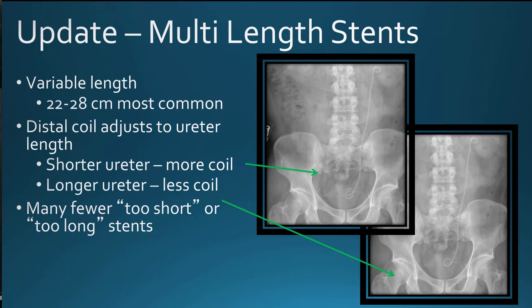Usually it's done at the time of stent placement, using the guide wire to calculate or show the appropriate length catheter, although it can be done with things like patient's height and other mechanisms. But there's still some difficulty in choosing the correct stent length.